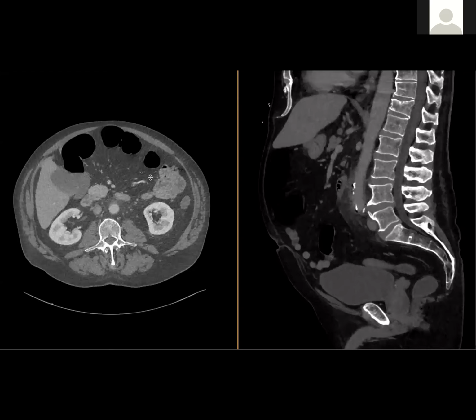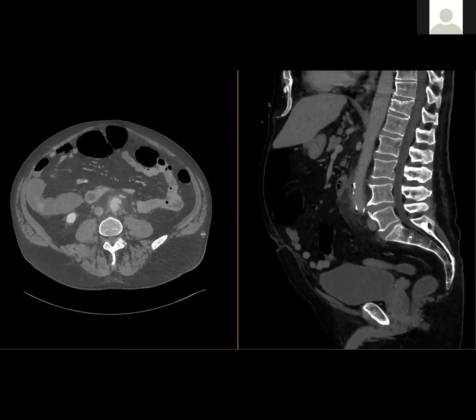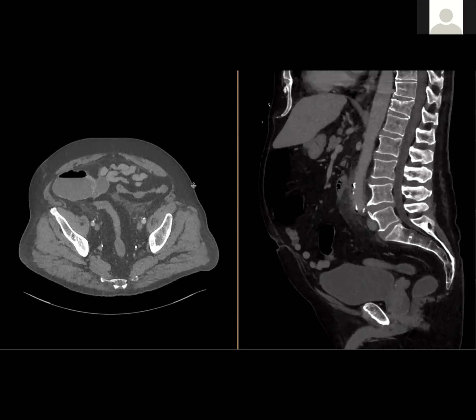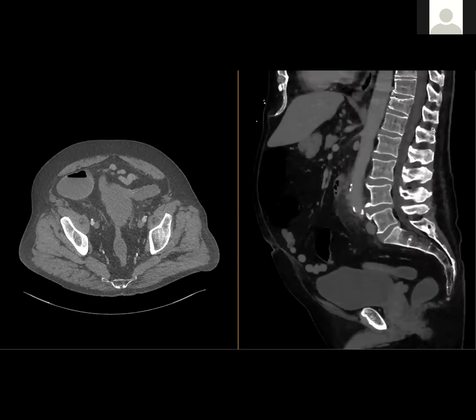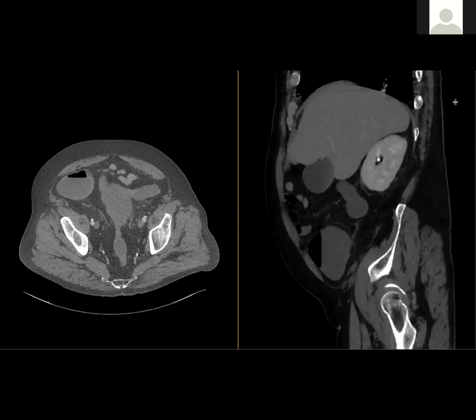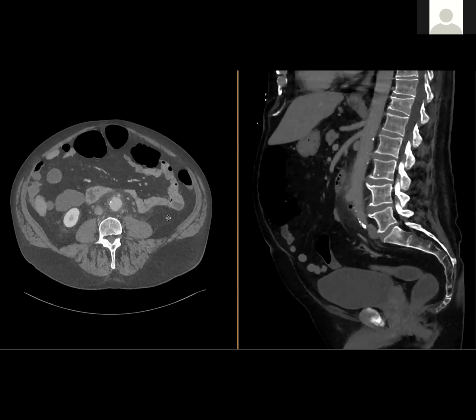This is a patient, an older gentleman, who presented to the ER with abdominal pain. So I'm just going to scroll through it. Any thoughts, anyone? An infectious aortitis. Yes, good. GW also says mycotic pseudoaneurysm. Cameron says aortitis, and Amar says mycotic aneurysm. Okay, so yes, yes, and yes.